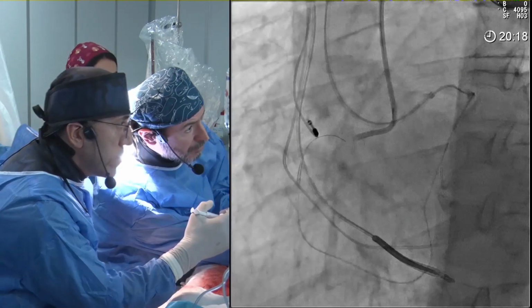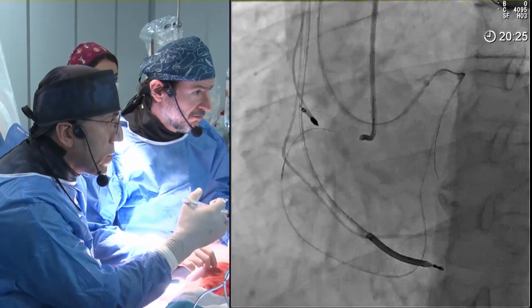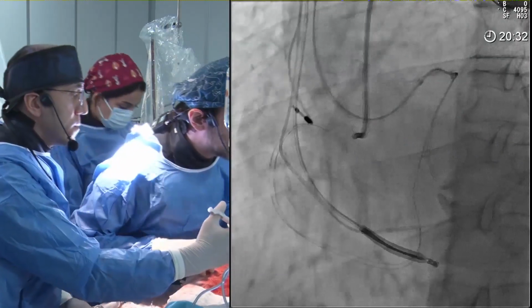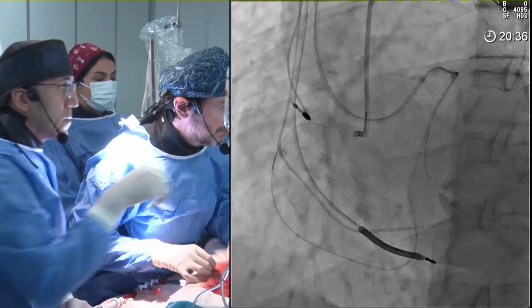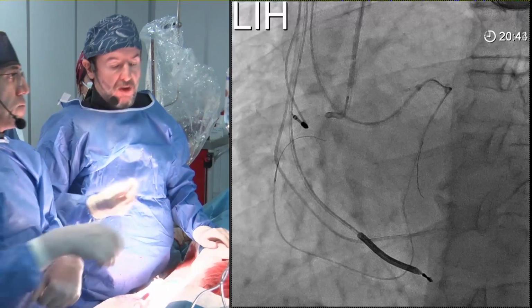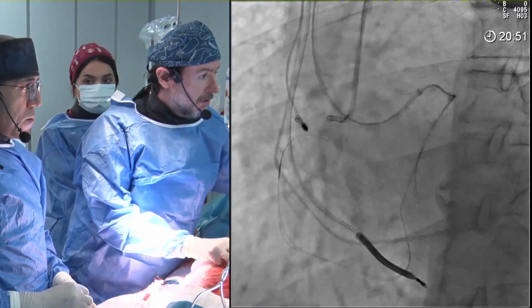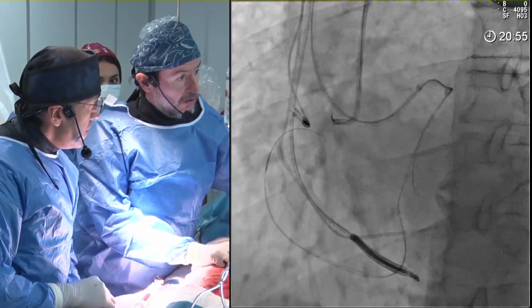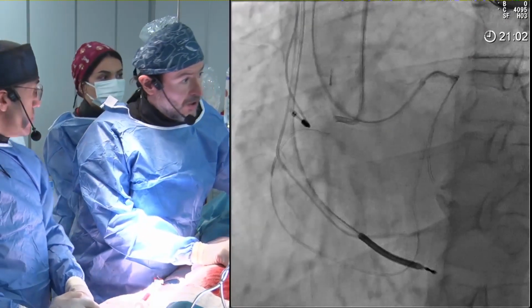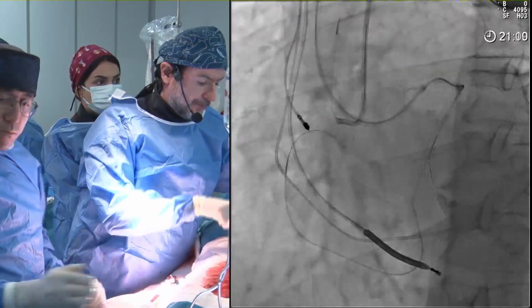Dr. Firouz? Yes, I think in this patient we have some kind of calcification in the right coronary upper part. At least CT can say whether it's aligned with the RCA or not, and the distance we can also assess with CT. On the other hand, I do agree with keeping the retrograde micro from this distance, because we should find the loosest part of the proximal cap for puncturing, and maybe it can help us to be safer, because when we want to use the hard wires, especially as our colleague said, sometimes the origin of the RCA is not direct, and it can have angulation, and with puncturing it can make a problem.